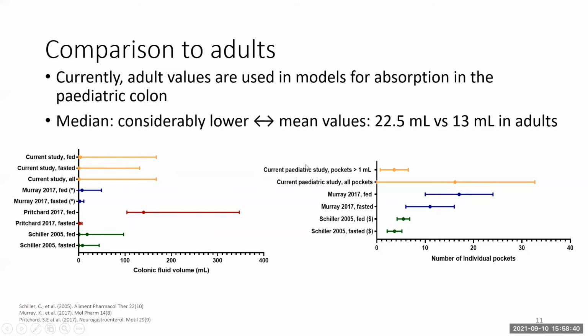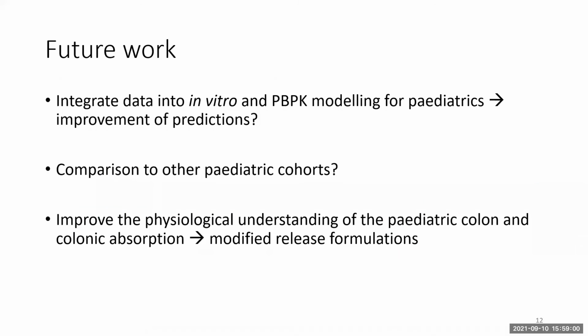When we look at the number of pockets, we also see that all pockets is quite bigger than the ones reported in adults. But if we look at the physiologically relevant pockets, we are comparable. The amount of pockets in children is comparable to adults.